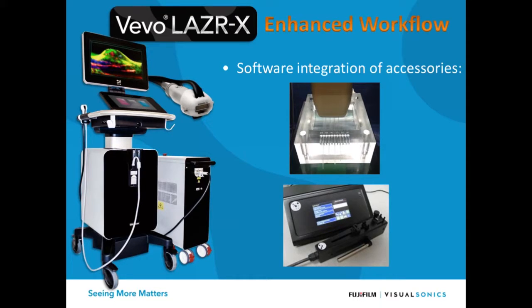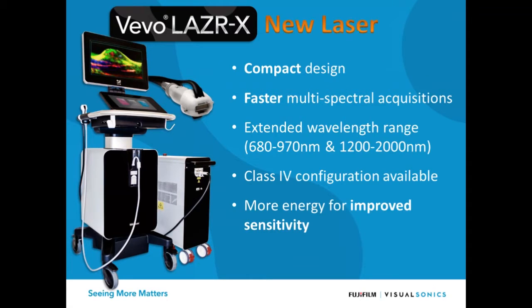And also our Infusion Pump. This is a pump we've been selling for a little while, but now we've integrated the operation of that pump into our Vevo software. So we can control the volume it's going to inject, how fast it's going to inject, and when it will inject. It'll also mark on the acquisition loop where you did the injection and the parameters of the injection as well. So we've gone to a lot of effort to really integrate some of these tools into the software of the system itself.